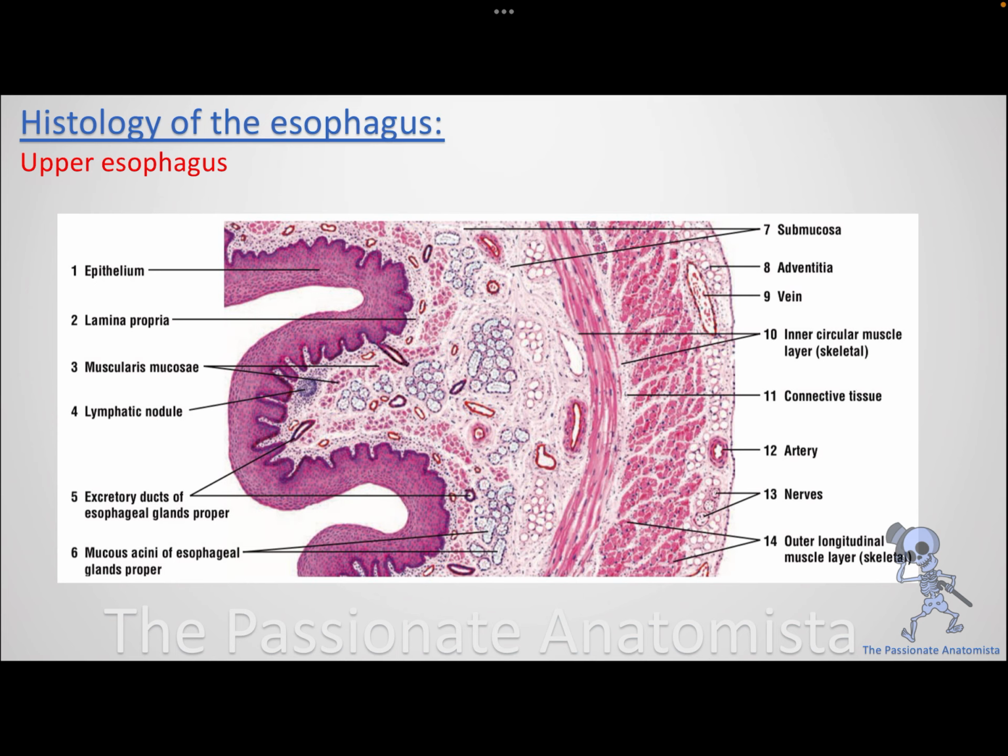Now, when it comes to the esophagus, I have a stratified squamous epithelium. Stratified means many layers. Squamous because there are a lot of cells in such a way that they compressed each other. They lost all the lines between them, and they show as so many layers of epithelium with so many nuclei.